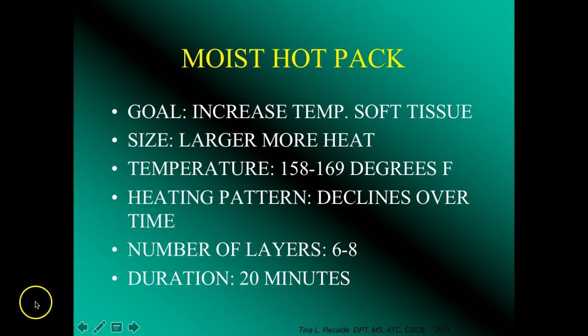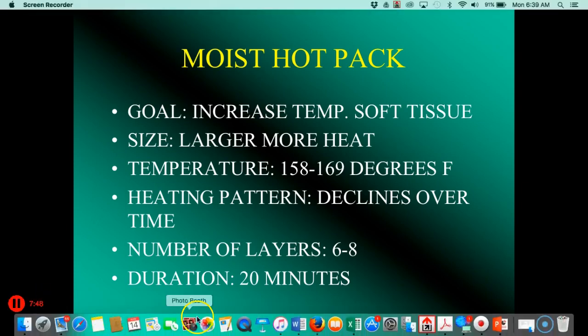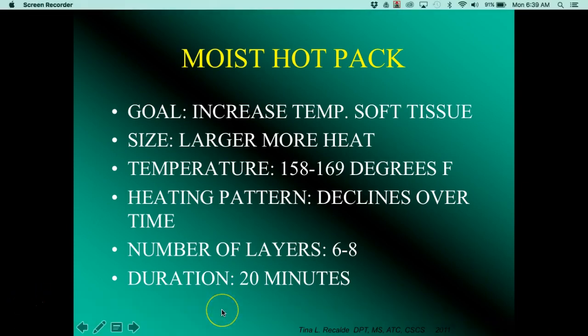So here's your moist hot pack. You have the goal of increasing the temperature of the soft tissue. Obviously, we already talked about this: the larger the pack, the more heat transfer you're going to get. The temperature of a hot pack is somewhere between 158 and 169 degrees.